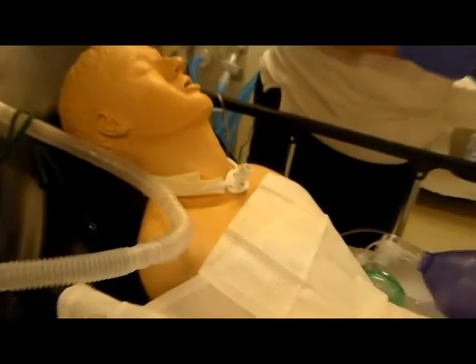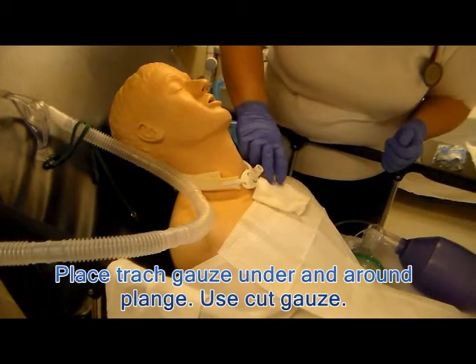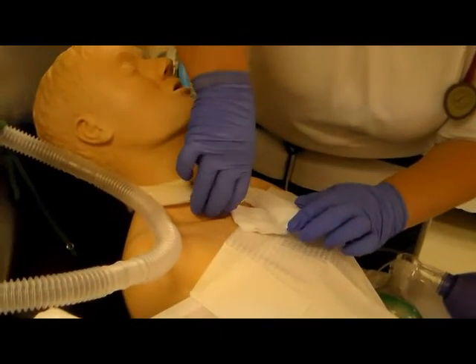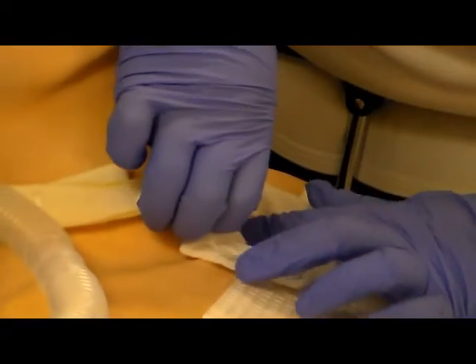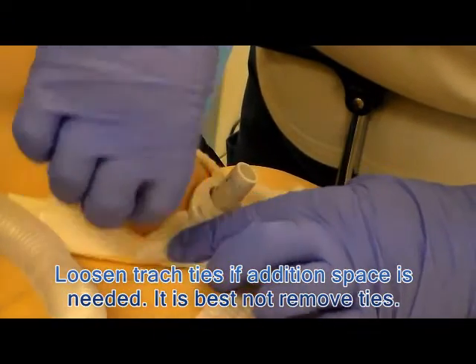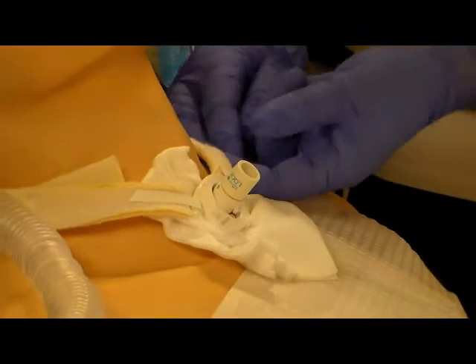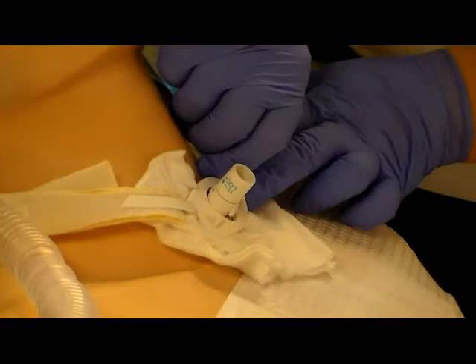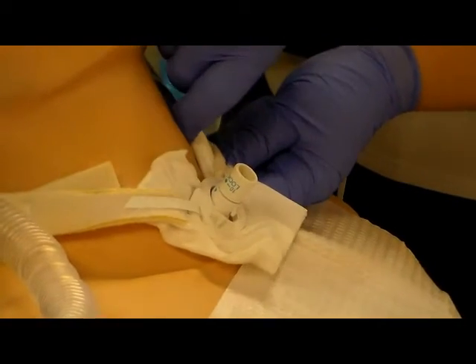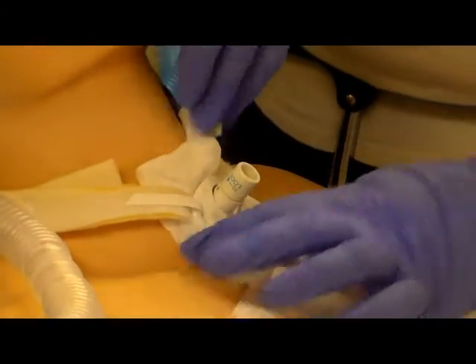Now we are going to place the gauze underneath the flange. Notice the slit is facing up towards the patient's head — it really doesn't matter, it is just a matter of preference and most people do it this way. Work it gently under the flange. You can also remove the trach ties at the same time, but that creates a little more concern about the patient coughing and potentially losing the trach tube while ties are removed. Once the gauze is under, note that at this point all gloves are being treated as non-sterile.